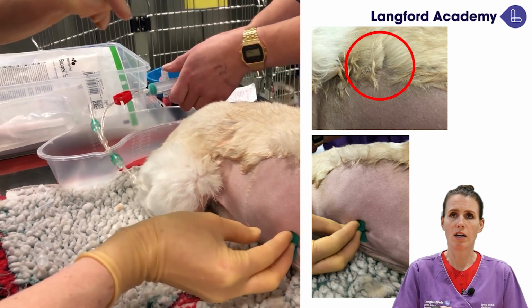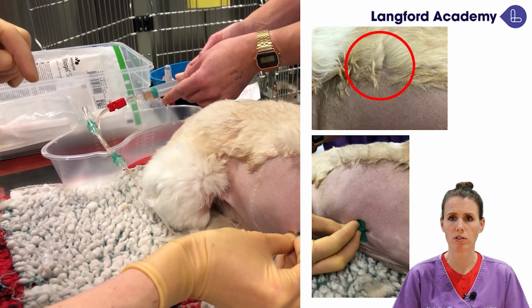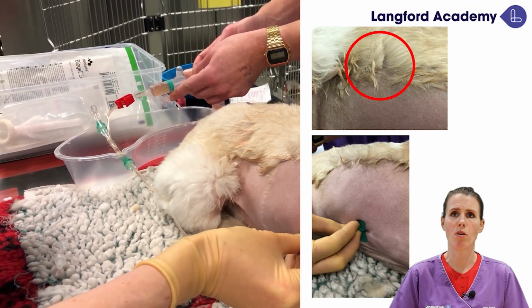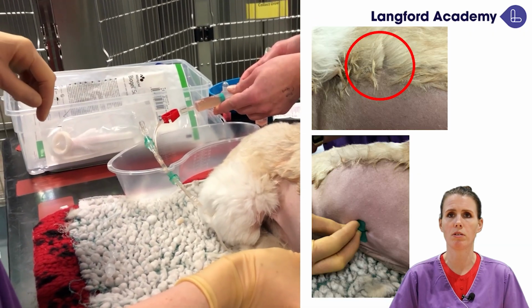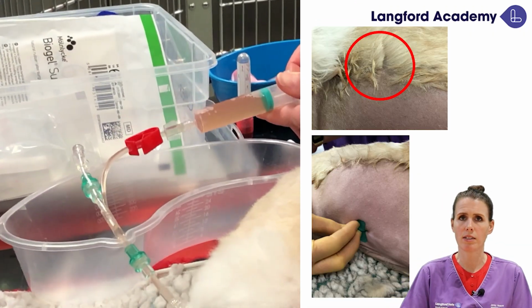of the chest. Our first sets of samples went into the sample collection pots, and we'll talk about what pots to use in a second. But ultimately, the remainder of the fluid, once we've collected our diagnostic samples, is getting put into the kidney dish. So this technique works really nicely.